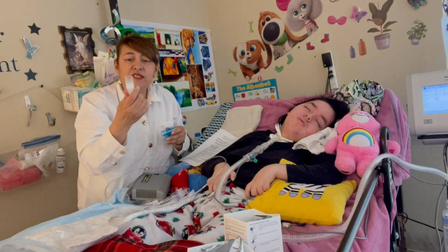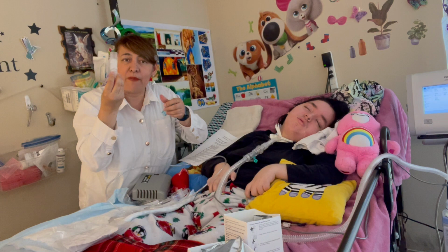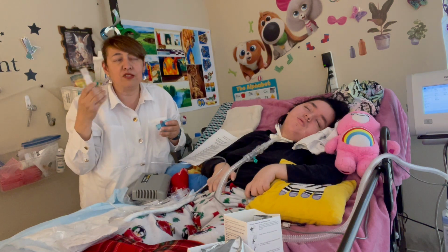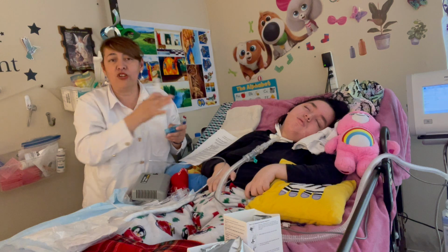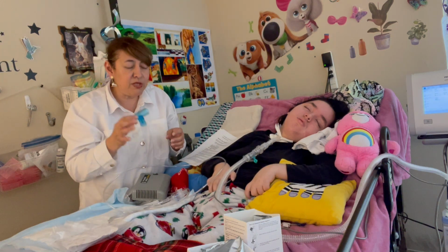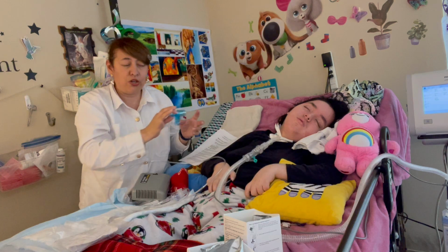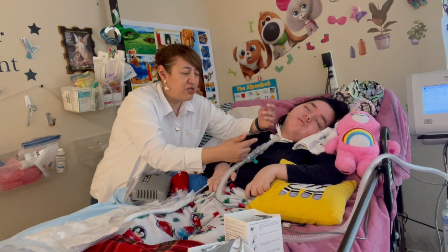We don't use this. This is like an accordion tubing. Accordion. I don't use that piece either. There are some other people that use it, because they are not on a ventilator, so they can do this. Let me show you how it works on my daughter. I'm not going to talk about this, but let me show you.